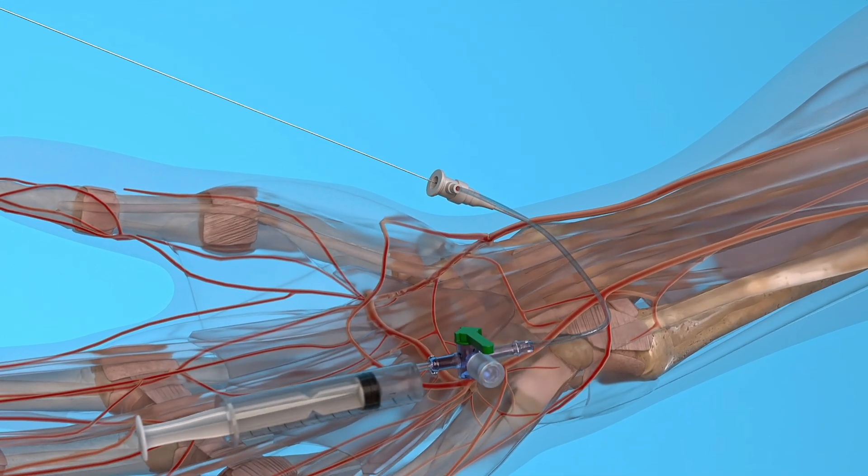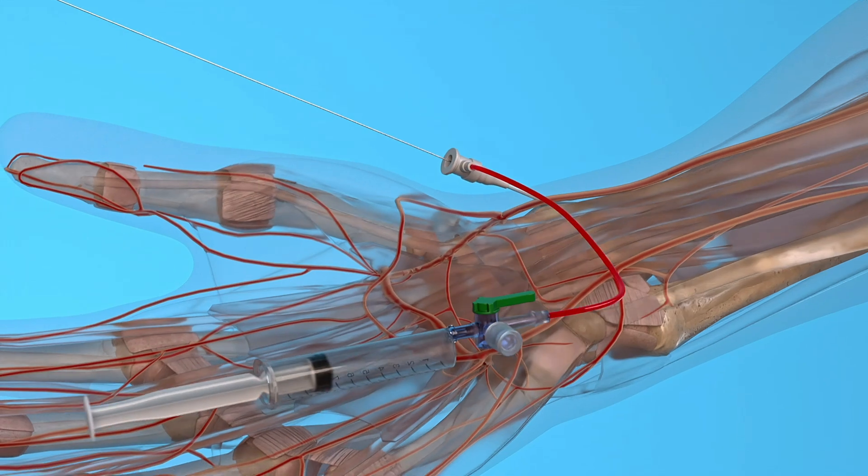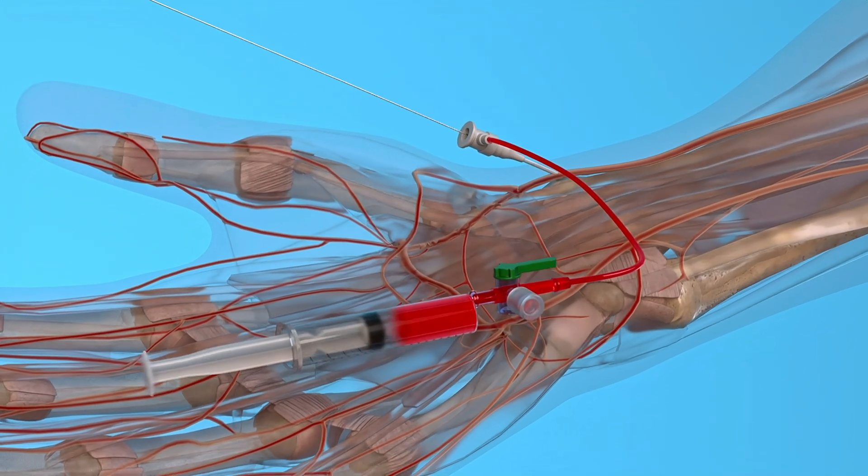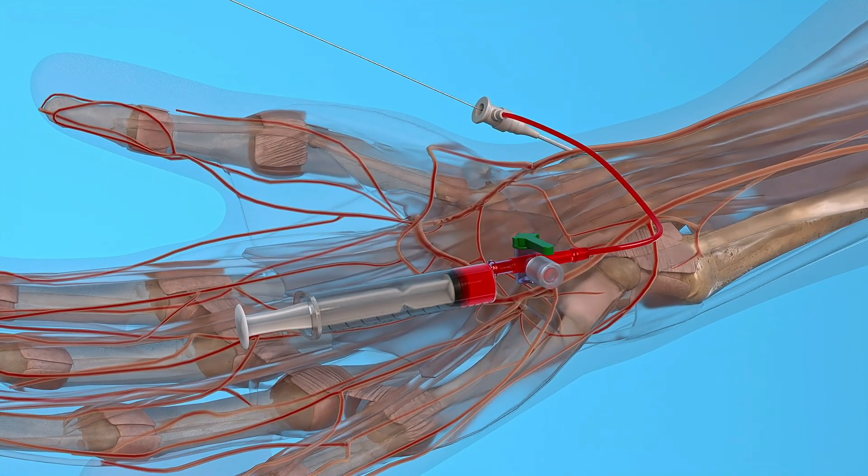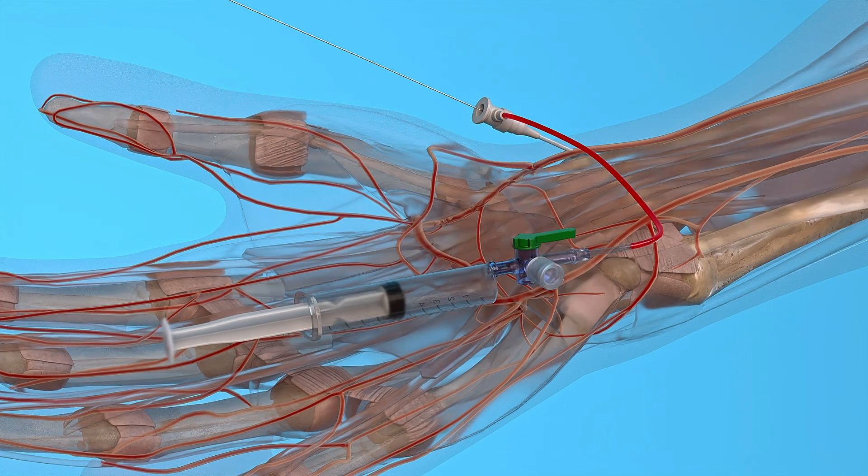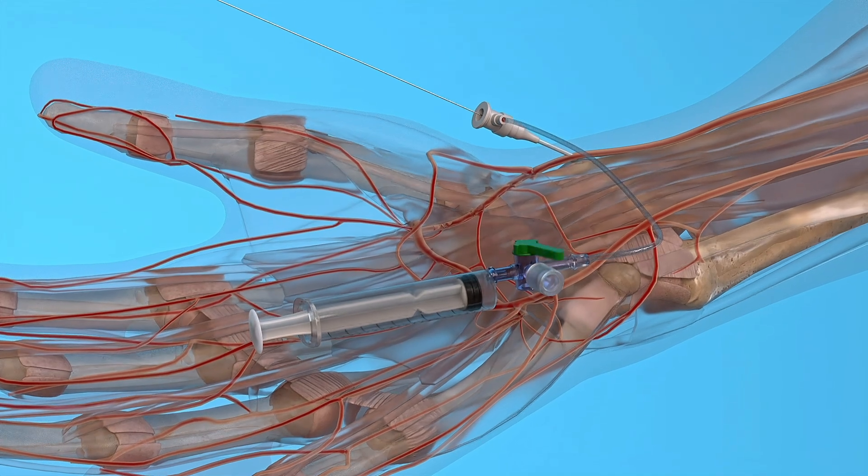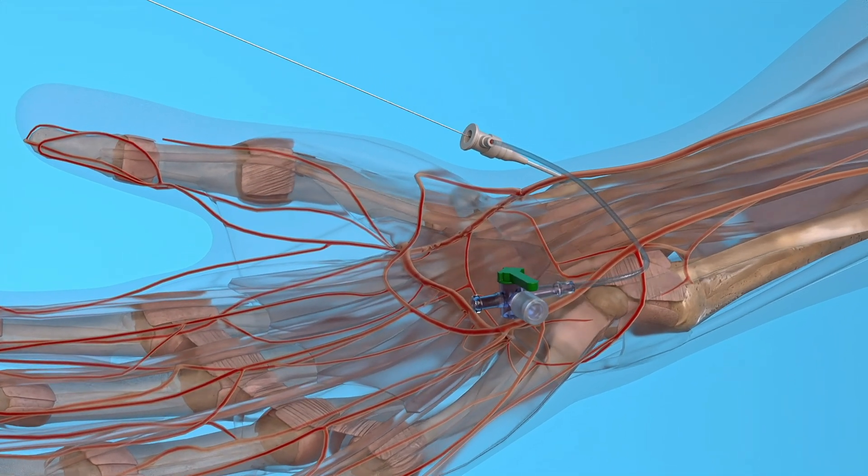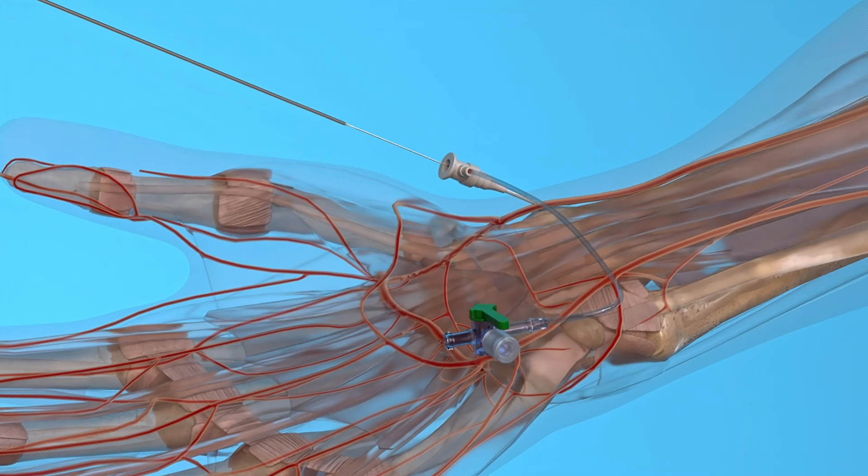The wire is then removed. After checking the patency of the introducer, it is flushed. Then a catheter is inserted.